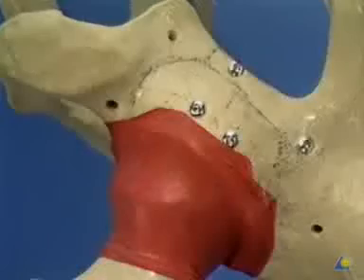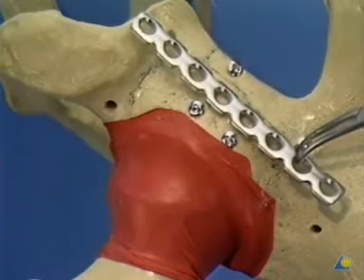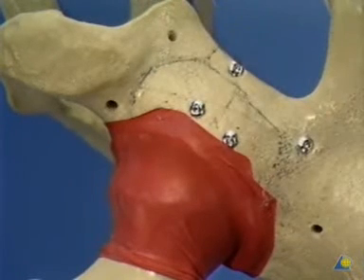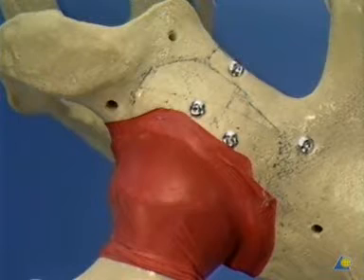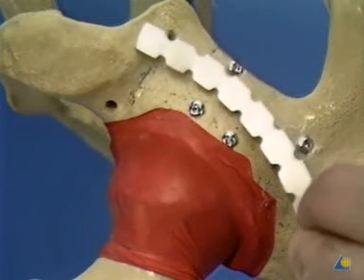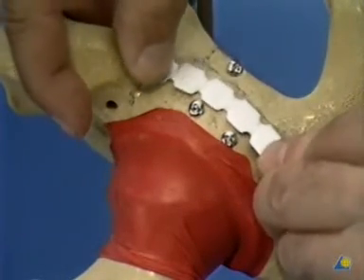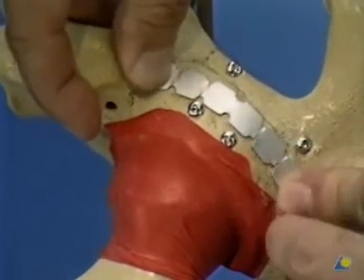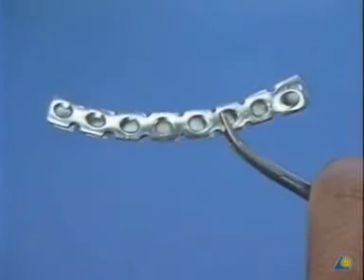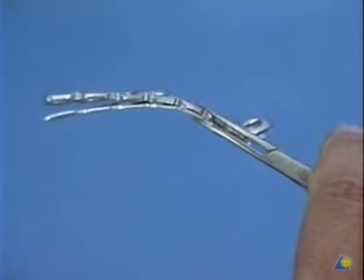A straight 3.5 reconstruction plate will be placed from the ischial tuberosity to the inferior ilium. The plate will be curved so that the curve roughly parallels the posterior rim of the acetabulum. The 3.5 bending template is contoured to the posterior column. It's seen that the plate is slightly under-contoured as compared to the template.